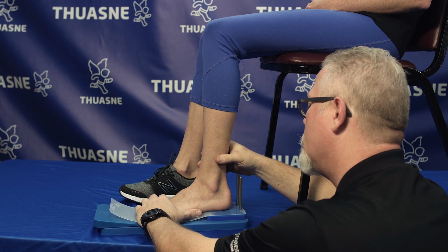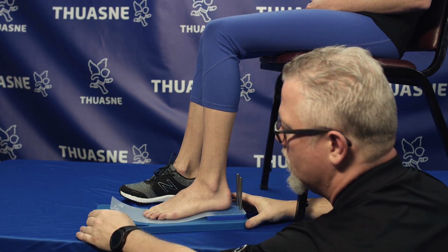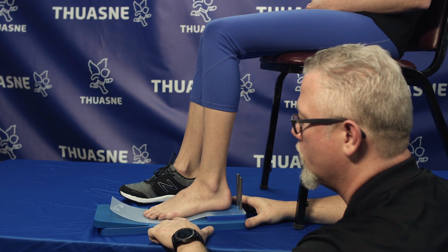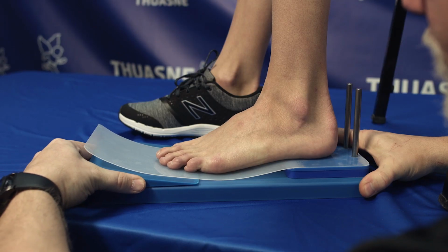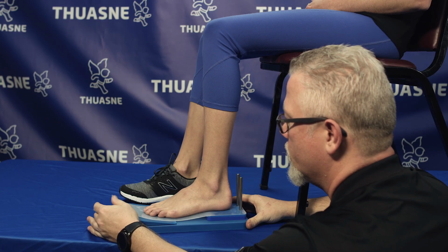We're going to make sure the patient is centered within the casting block itself, and we need to work on our toe extension. Now, the toe extension, just like when you measured, we're going to use the metatarsal break. So the edge of the toe ramp will slide like so till we get center metatarsal head.